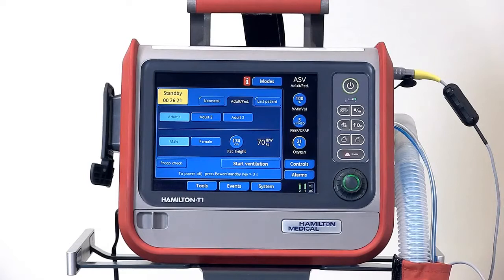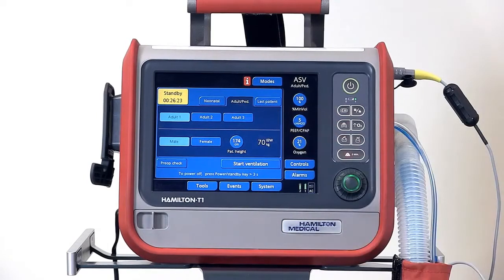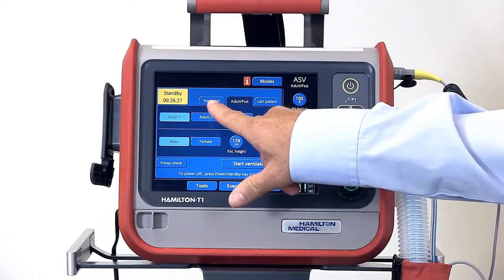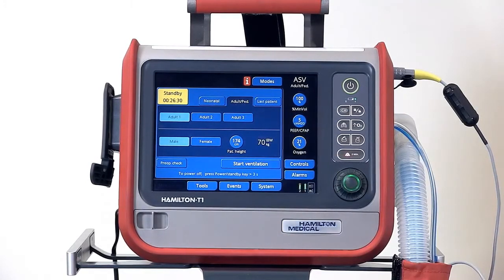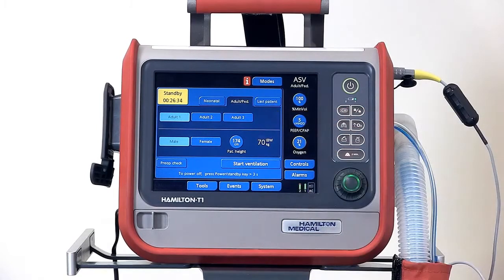First, select the patient group. Adult pediatric is for adult and pediatric patients down to 3 kilograms, or select neonatal for newborns up to 30 kilograms. You can also select last patient, which inputs the settings from the last time the ventilator was used, so don't use that on new patients.